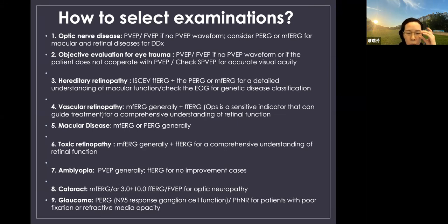For glaucoma, we have a lot of image analysis, but for functional evaluation, pattern ERG and photopic negative response are also good for follow-up and for evaluation of their optic nerve function.